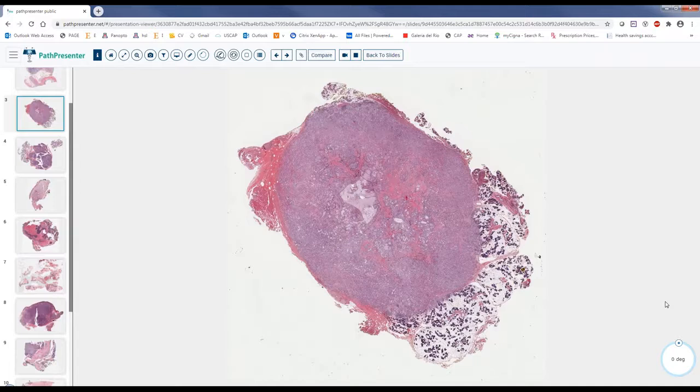Okay, so in one word, yes or no: well circumscribed or not well circumscribed, or ill circumscribed if you'd like to use that. Yes or no? Excellent. So this is a well circumscribed lesion. And we say that a benign lesion will usually be well circumscribed, but also a malignant low-grade lesion can be well circumscribed.